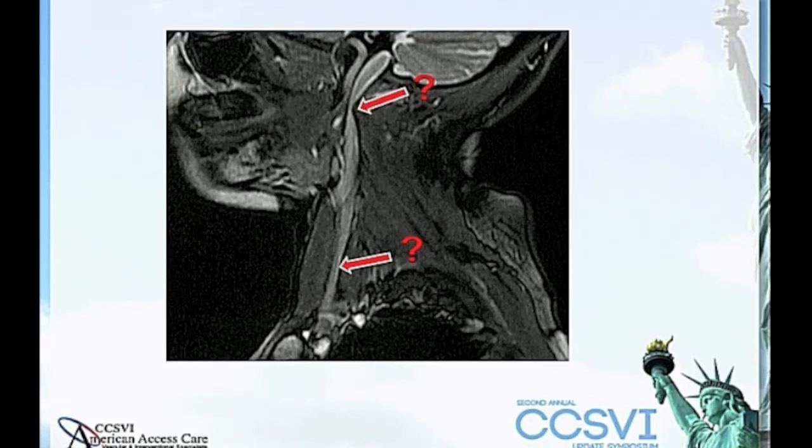Of course, in these patients sometimes we also observe localized collapses. At the moment, we don't know the reason for these findings. Maybe there are just areas with increased external pressure. Maybe, as Dr. Tucker has proposed, it depends on the so-called standing waves, but of course it should be discovered in the future.